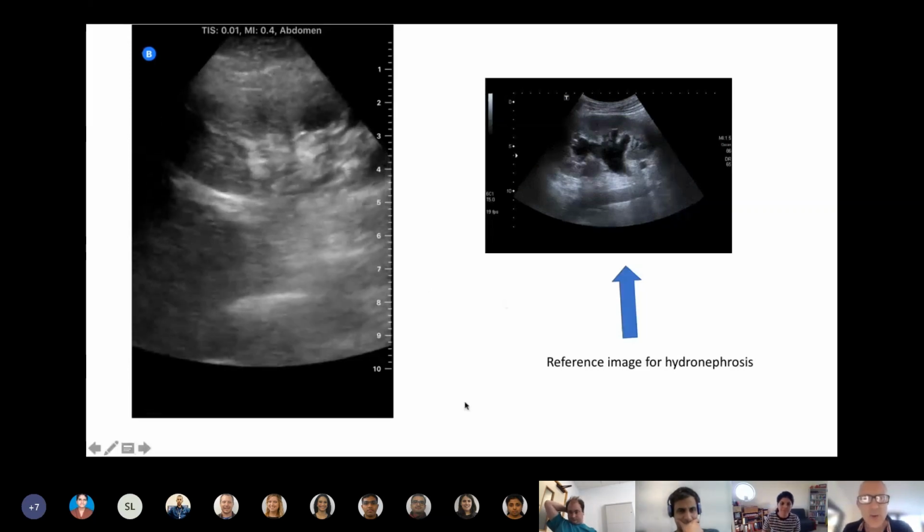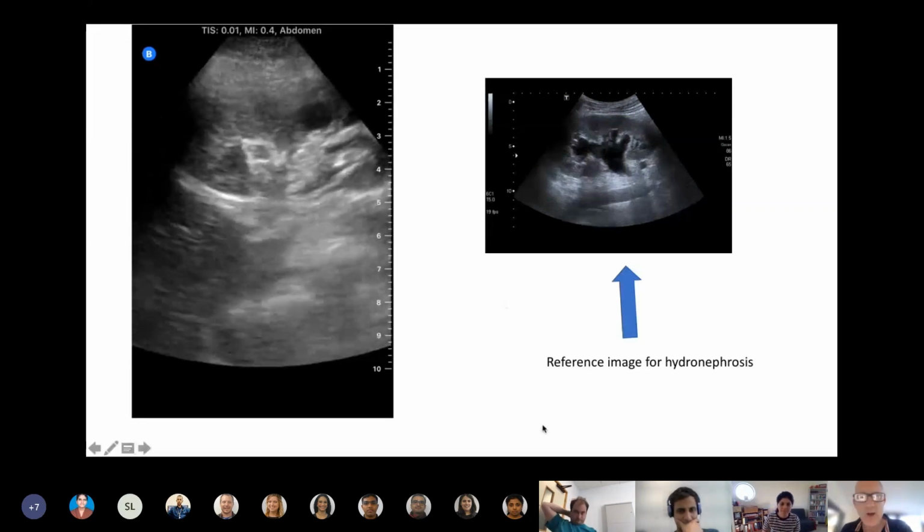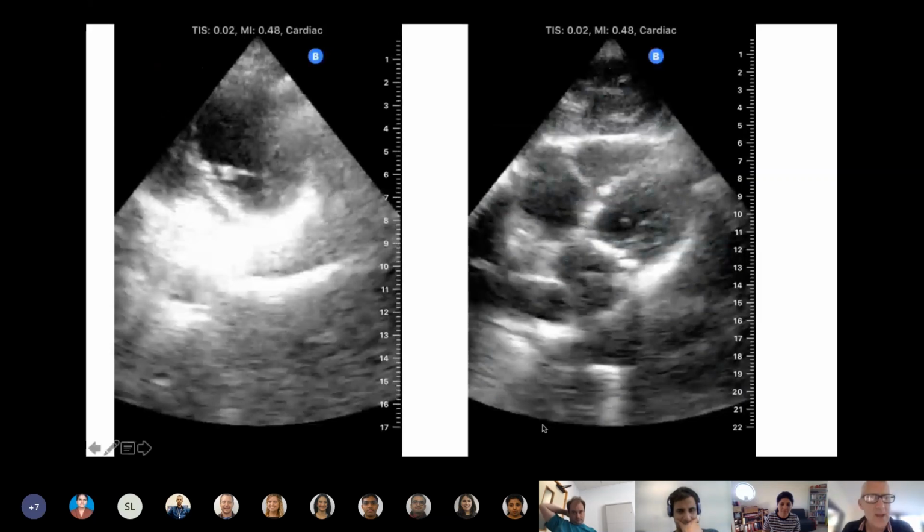So it's useful to know we're probably dealing with medical causes rather than an obstruction. You know she's got heart failure. So actually we want to say, what is this ventricle doing? And this is the challenge I'm finding. I've got one case here. The challenge is actually about positioning patients, because you've got a care home bed where they lie flat, you've got a high back chair where they're propped up, but you don't have this hospital bed where you can adjust and get optimal images.